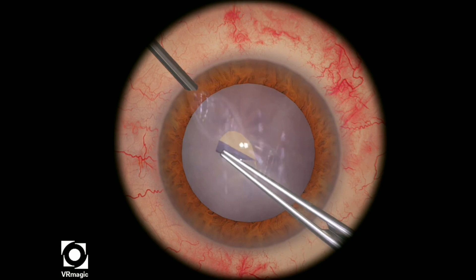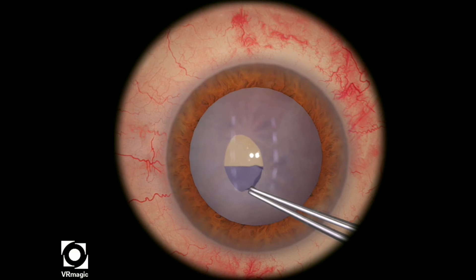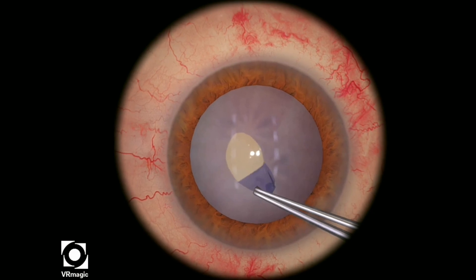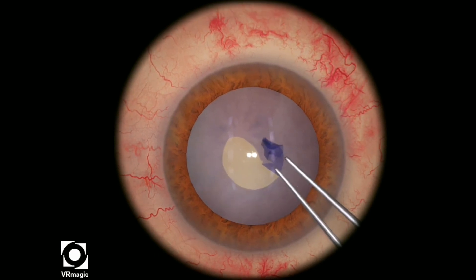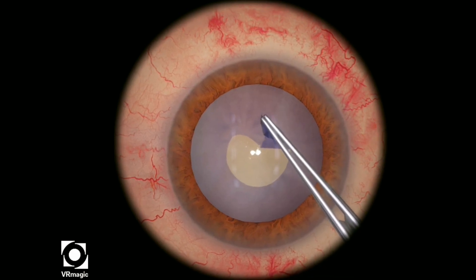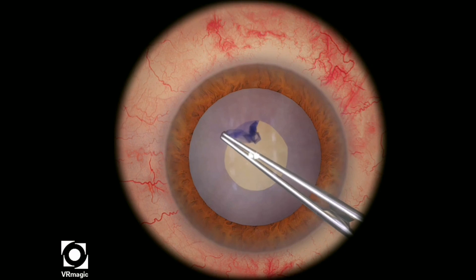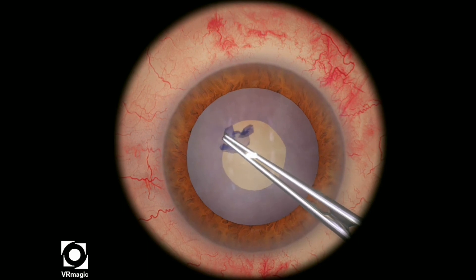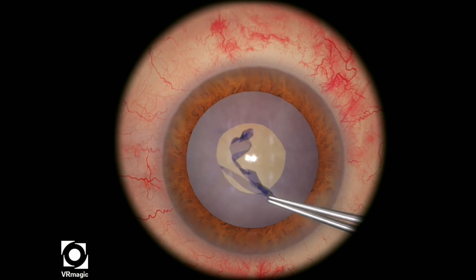Here I'm being very gentle because I know that I want to try to get the best shape possible, but the capsule is very brittle, so it doesn't really want to do what you think it normally does. You have a lot less control in terms of the shape and the regularity of the rhexis. So be very slow, methodical, and try to create the best rhexis possible in this particular situation, which is not ideal.